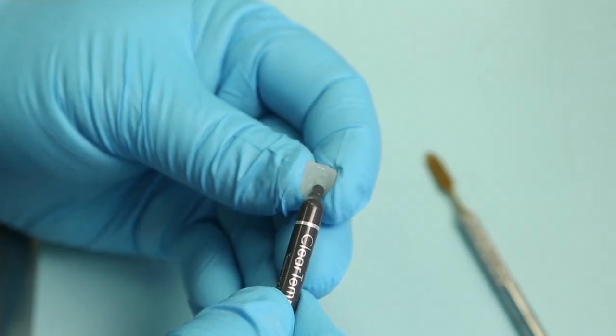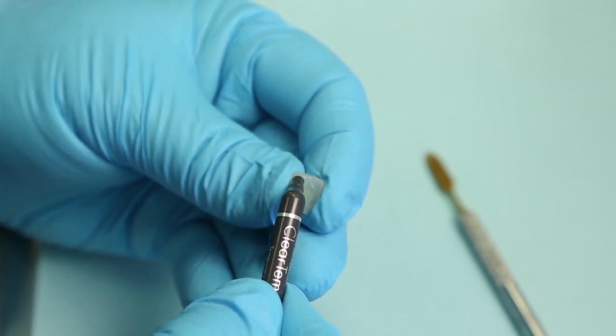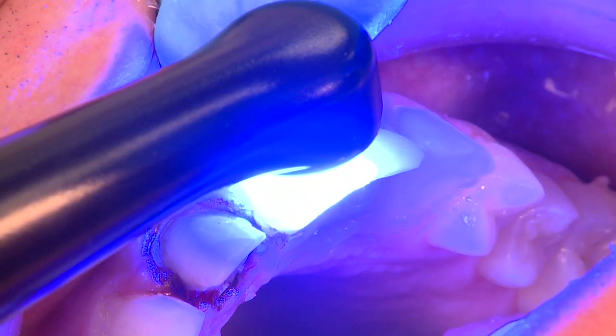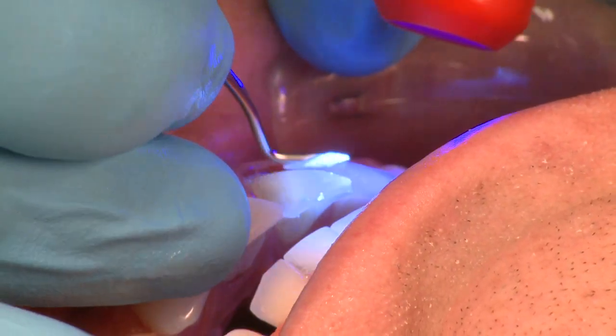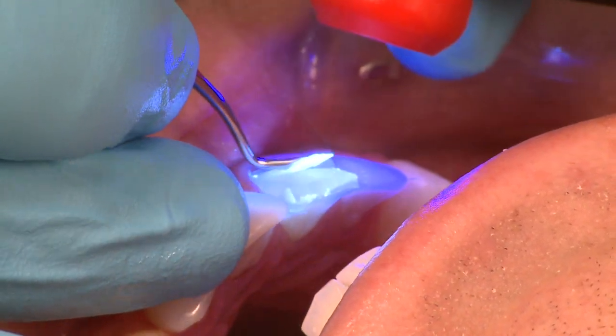So ClearTemp LC is designed to totally seal and totally coat all the preparation and all of the underside of the veneer. Light cured, removing the excess with ease. Upon definitive cementation, one simply hits the surface with a black light to assure that all of this clear provisional material is removed prior to definitive cementation.